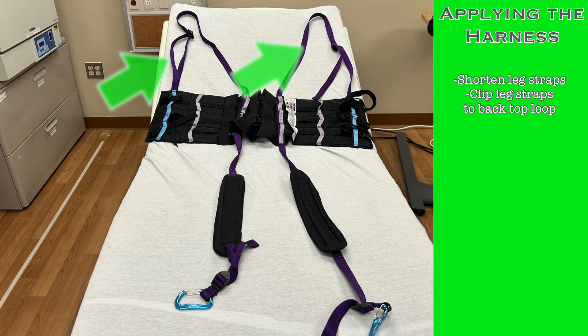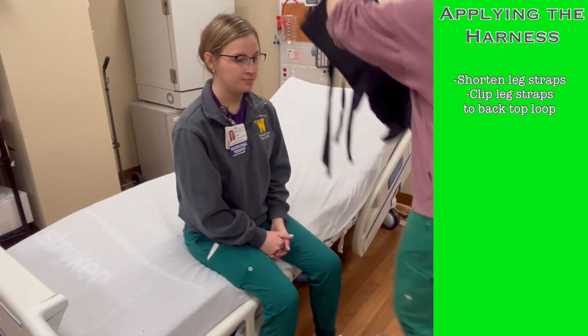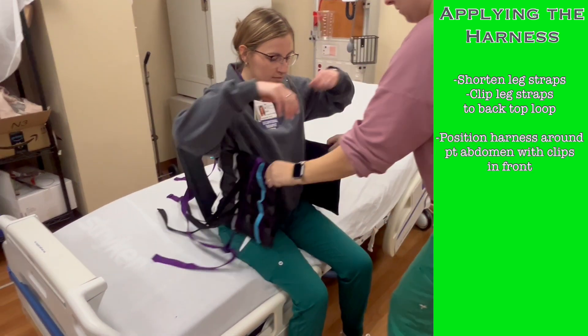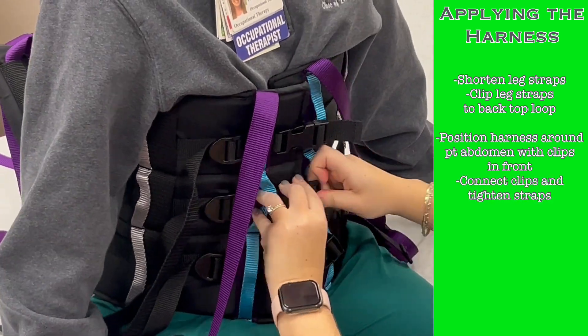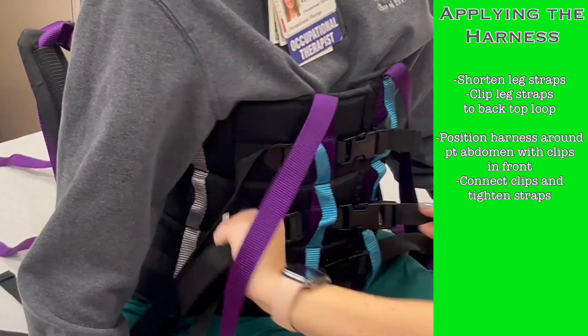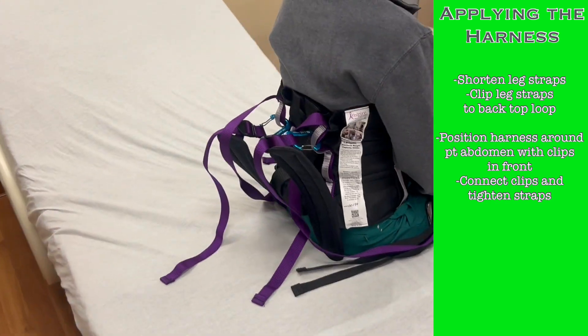There are also two looped straps extending from the top of the harness that will be used to attach the patient to the lift after applying the harness. With the patient in a seated position, wrap the harness around the patient's abdomen so that the clips are positioned in the front. Connect all the clips and pull the straps of each clip snug. If it's too loose, the patient could slide down into the harness when lifting, so ensure a snug fit.